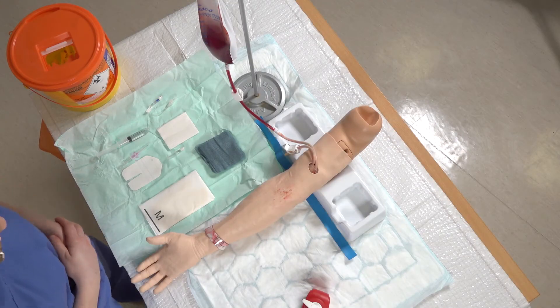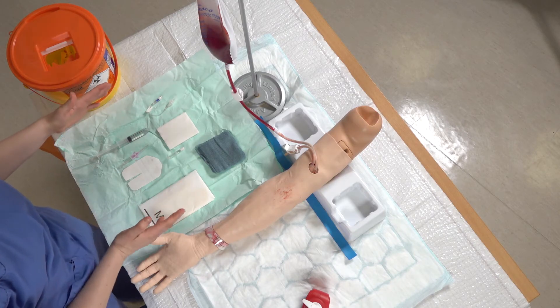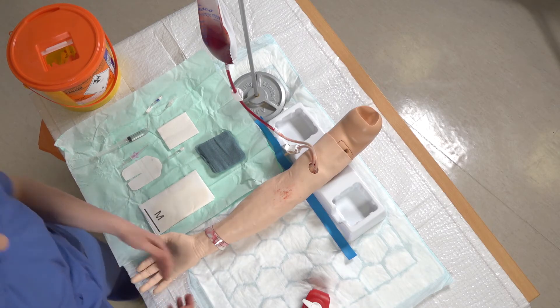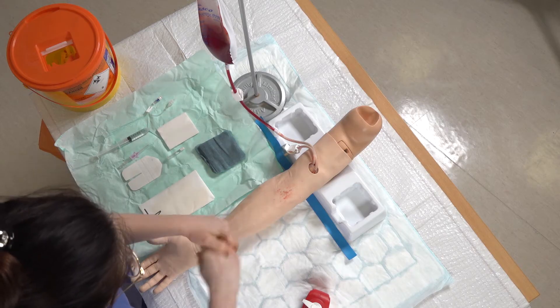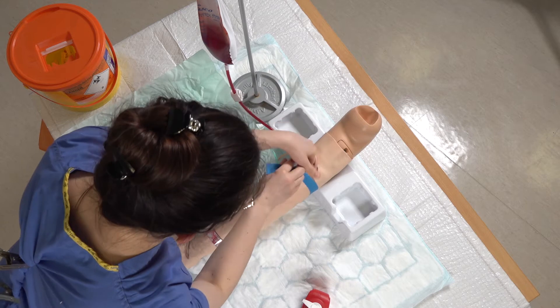Hello, so today we're going to be doing IV cannulation. I've got my sterile field set up with my equipment, my patient, my alcohol gel. I start by cleaning my hands with the alcohol gel and then I'm going to place the tourniquet around the arm.